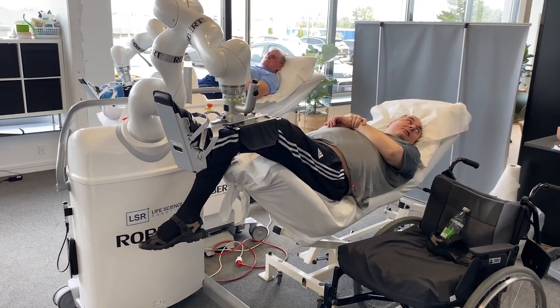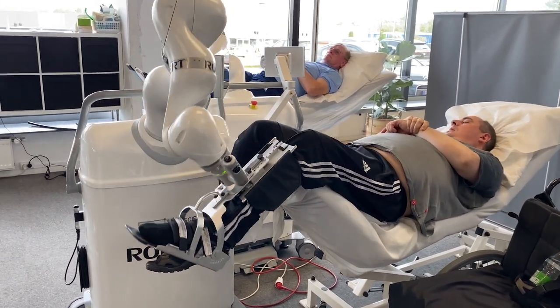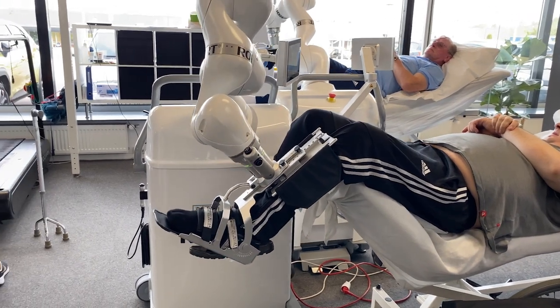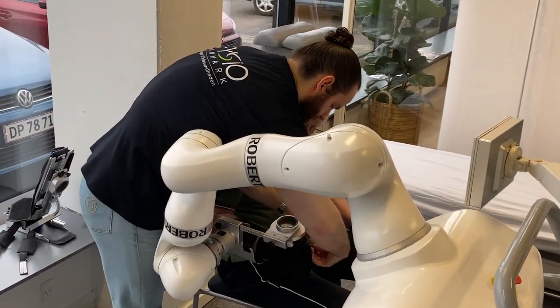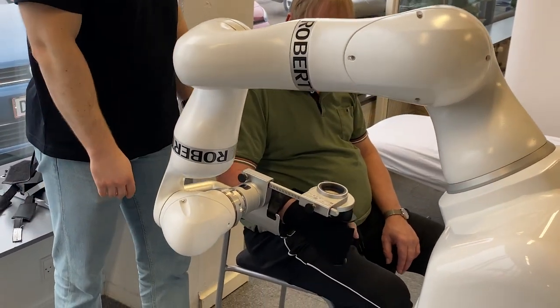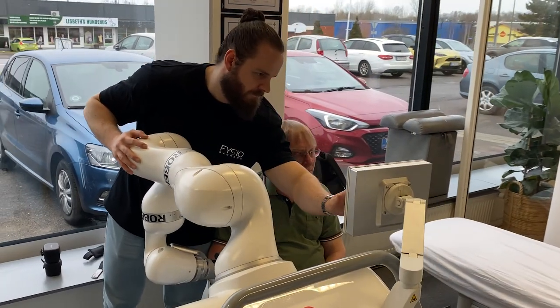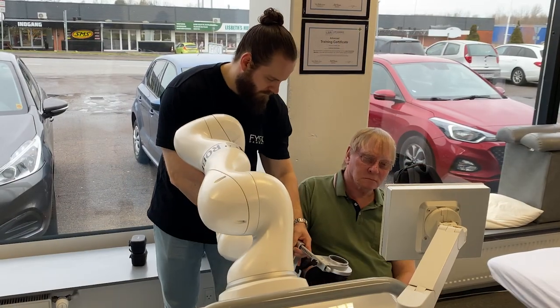It's really a step up in the intensity of their training and it's showing good progress for them. Right now, patients come in and out of the normal neurological rehabilitation process and we've been screening them since we got the robots — looking at which patients we feel would actually benefit from ROBERT, because they have to meet certain standards for it to make sense to go in the robot. We've been asking them if they want to try it, and if they do, it's perfect.